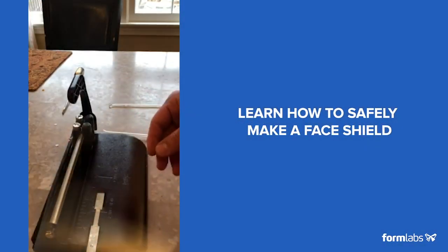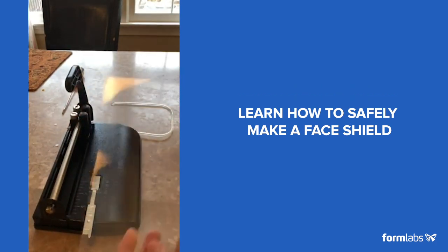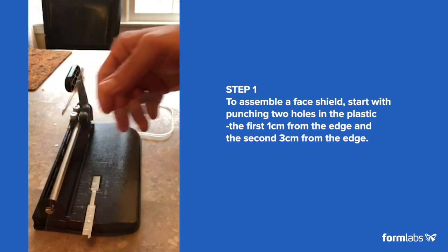I'm here just to give the instructions for the assembly of this thing. It's not a big deal. We should have a hole about a centimeter from the edge, and a second hole about three centimeters from the edge.